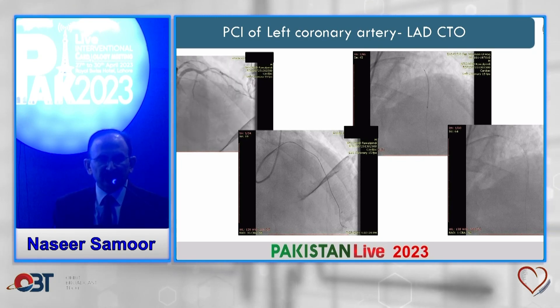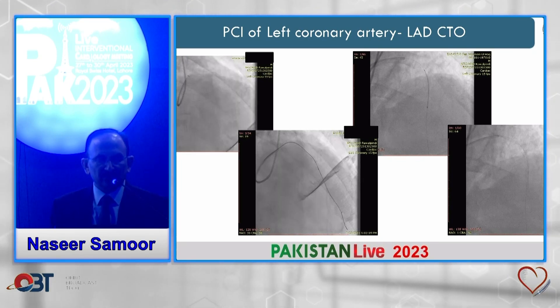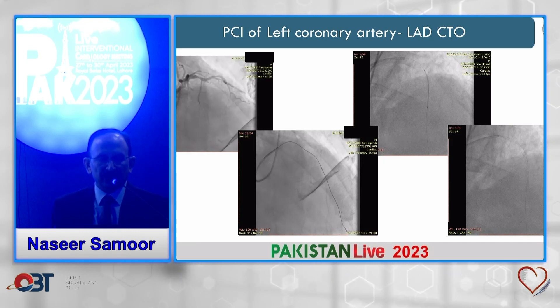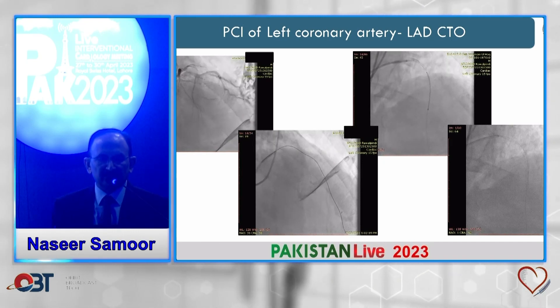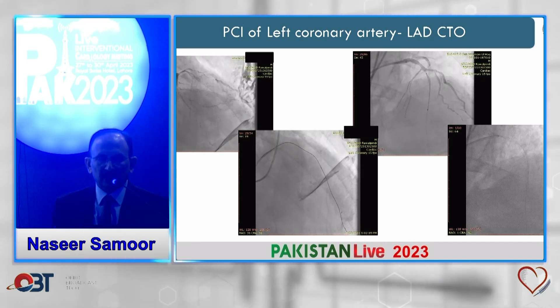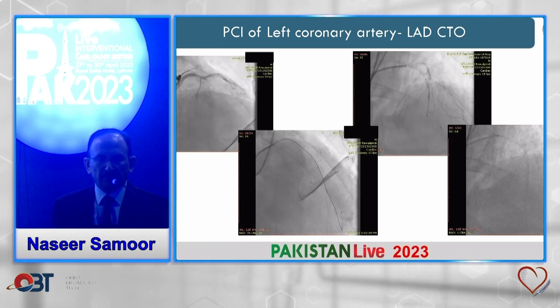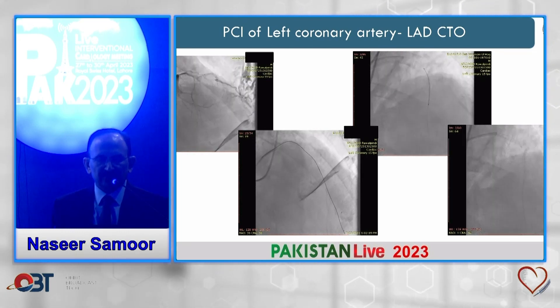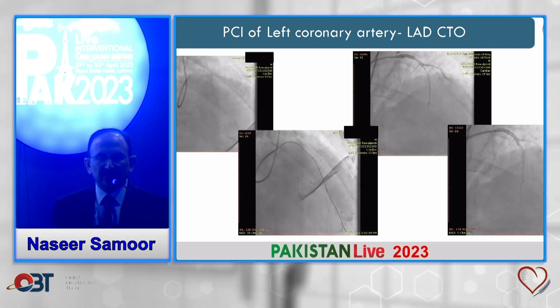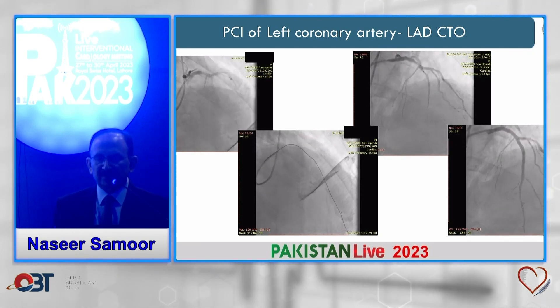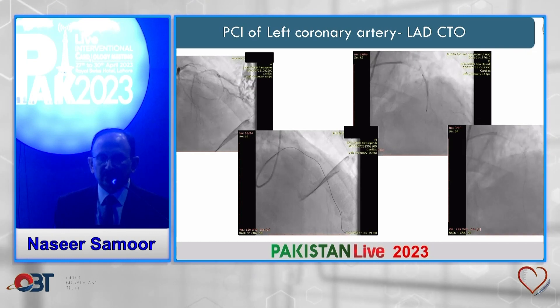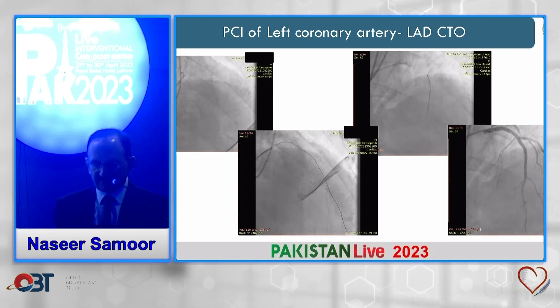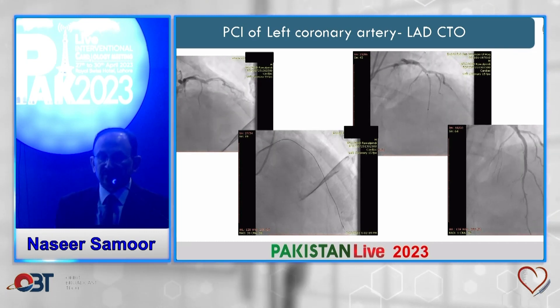This is a CTO of the LAD which was done with the XB catheter. Here you can see the Gaia wire sitting in the LAD, which was then changed to a workhorse wire, and you can see the final result.